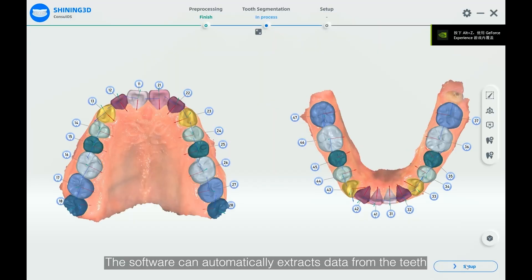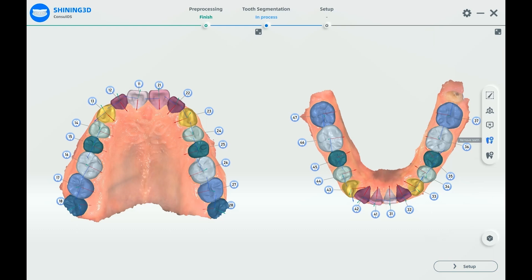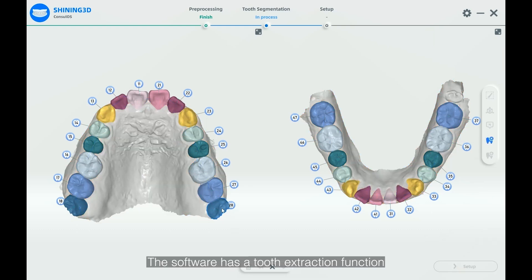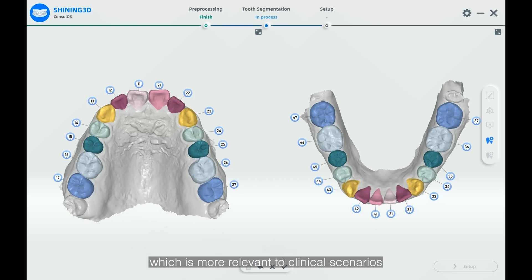The software can automatically extract data from the teeth. It also has a tooth extraction function, which is more relevant to clinical scenarios.